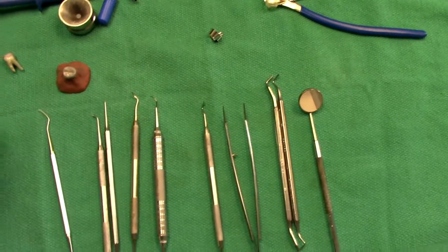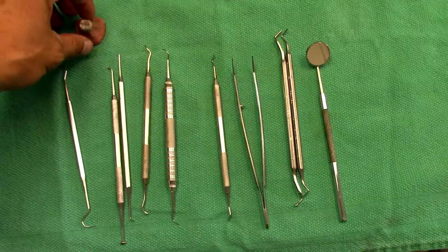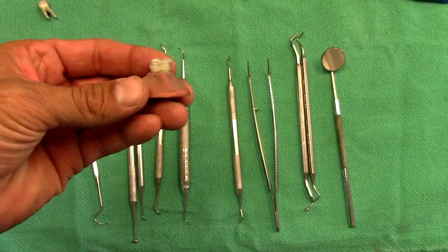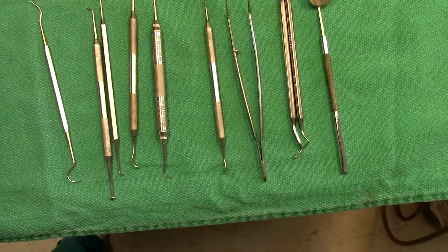Okay, so instruments you're going to need for the 5-surface amalgam tabletop session is obviously an extracted tooth. What you can do is you can mount it.